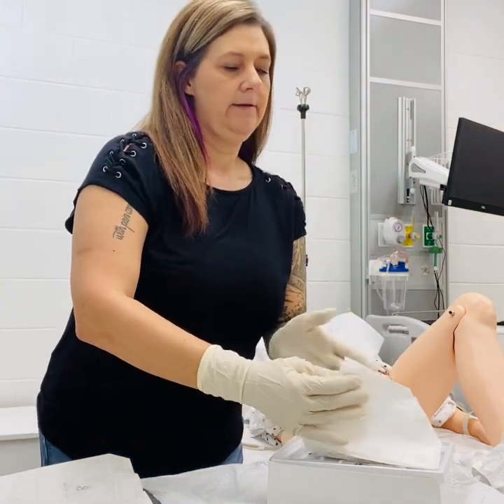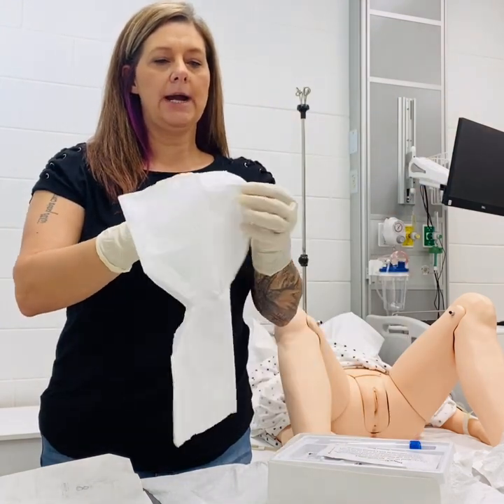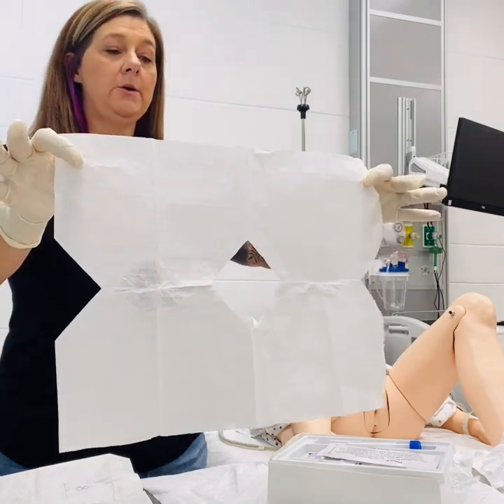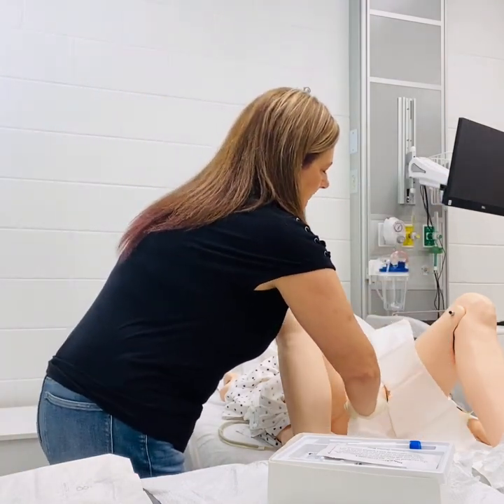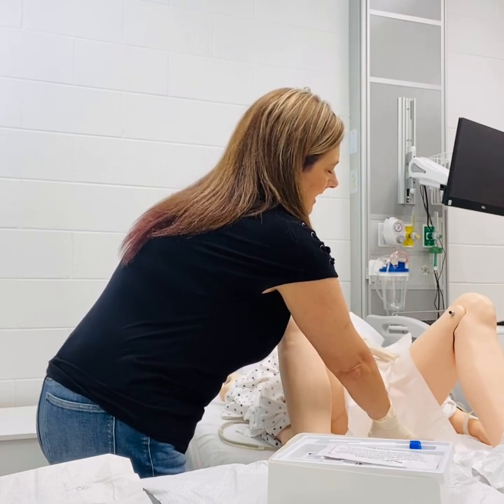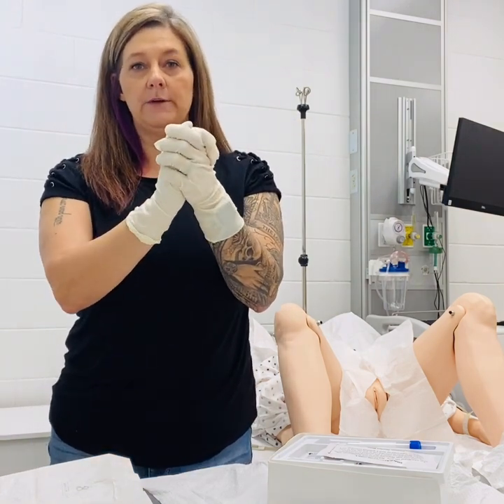Second, we have this fenestrated drape to place over the patient's perineal area. This just helps prevent any splatter, and it also helps for you to see the area. We'll want to place this without contaminating our hands. If at any time during this procedure you do contaminate, you would want to stop and put on a new pair of sterile gloves.